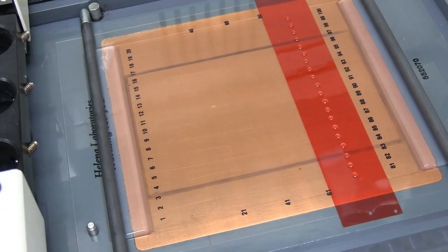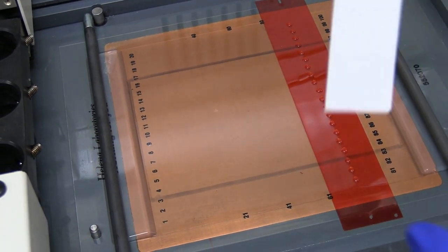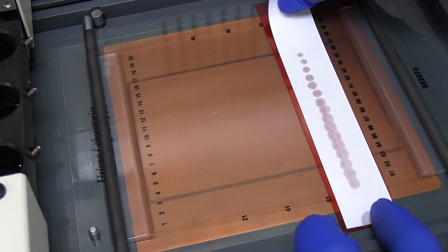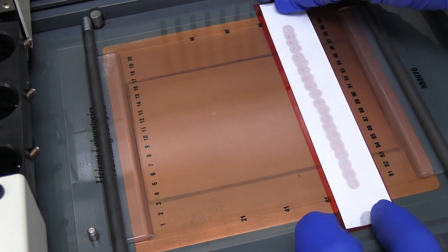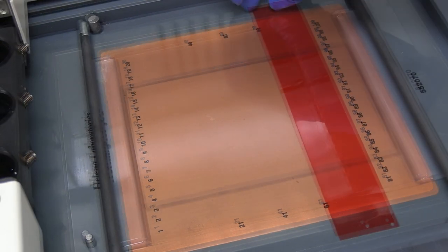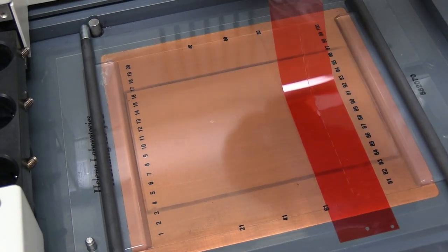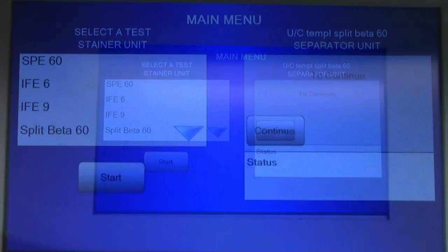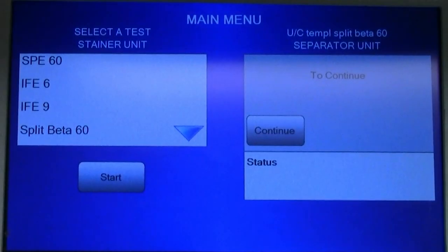After sample application is complete, open the chamber lid and gently blot the unabsorbed urine from the urine template with the blotter A+. Carefully remove the blotters and templates and discard as biohazardous waste. Close the chamber lid and press the continue button to begin electrophoresis. The SPIFE Touch will continue processing the gel as usual.